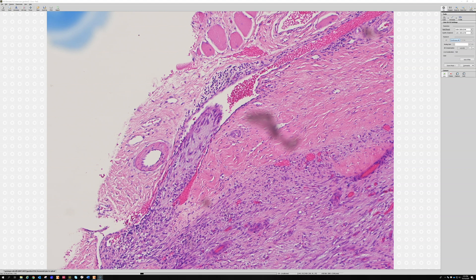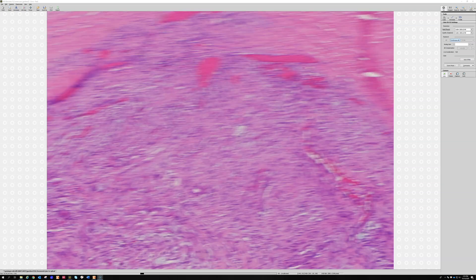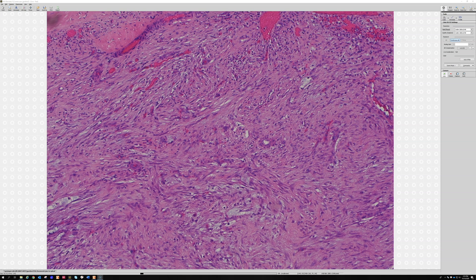Nodular fasciitis can involve the lumen of a vessel - don't be alarmed. Some cases are purely intravascular and may be closely related to organizing thrombus, which can also look fasciitis-like. This is not a sign of malignancy. In many tumors, cells in a vessel would be very concerning, but for nodular fasciitis, intravascular involvement can occur.